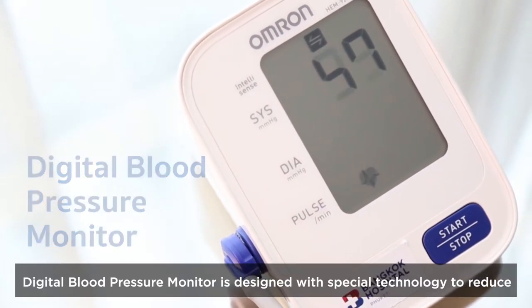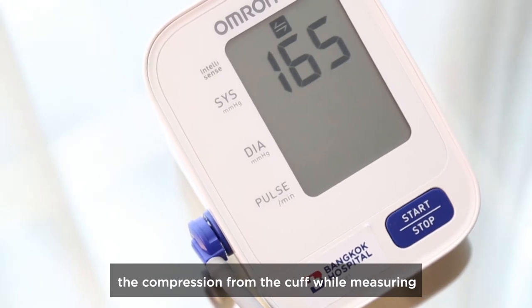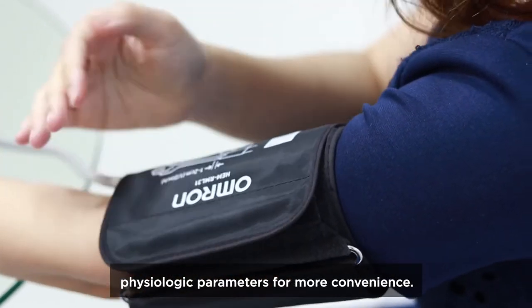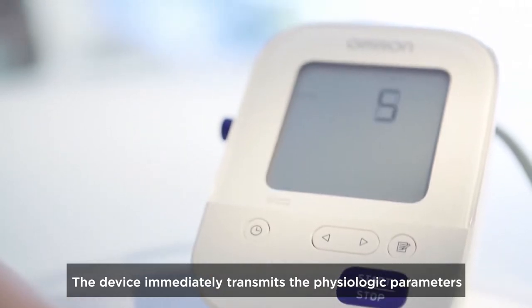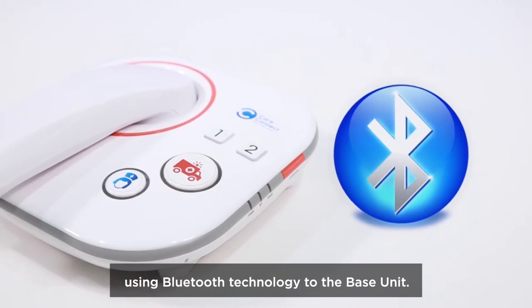The digital blood pressure monitor is designed with special technology to reduce the compression from the cuff while measuring physiologic parameters for more convenience. The device immediately transmits the physiologic parameters using Bluetooth technology to the base unit.